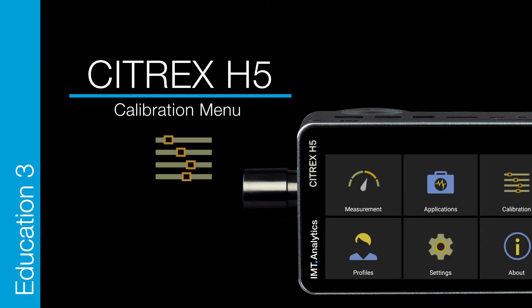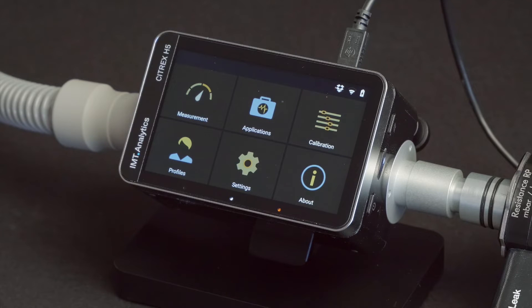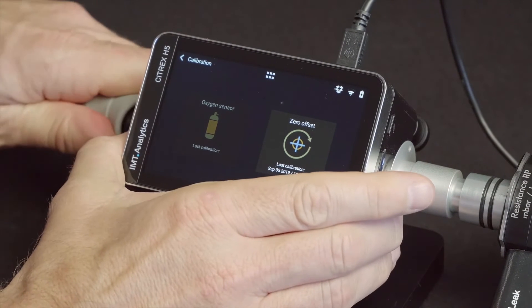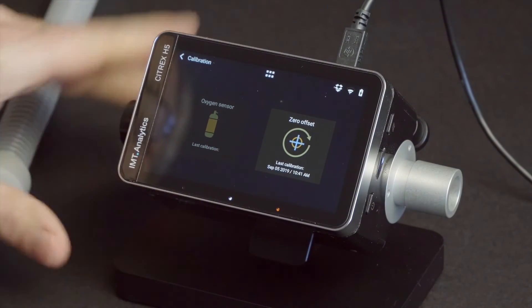Let's start. Go for calibration. Zero calibration will compensate offsets for all measurements and should be performed after a warm-up time of approximately 5 minutes. To perform a zero calibration, disconnect all tubes from the Citrex device.